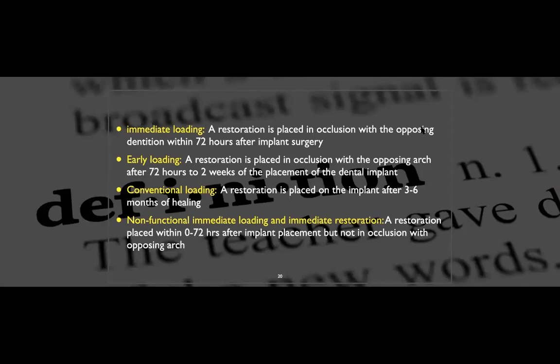Immediate loading is when the restoration is placed in occlusion with the opposing dentition within 72 hours after implant surgery. That means if the patient walks into your office, you do the surgical procedure, you take an impression, you send it to the lab, and the patient comes up to 3 days after surgery to get their temporary installed on the implant that you just placed, that would be considered an immediate load. Okay, up to 3 days, all right?